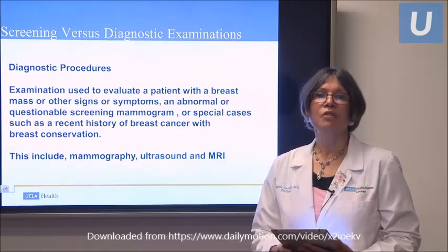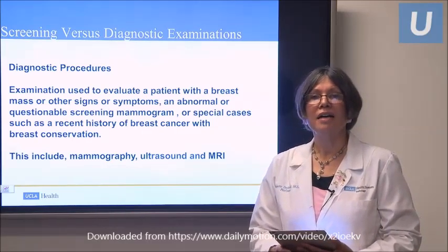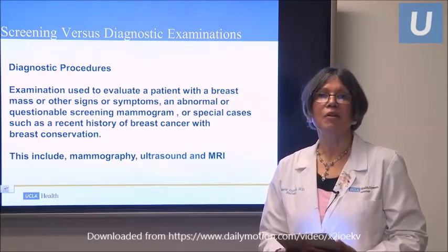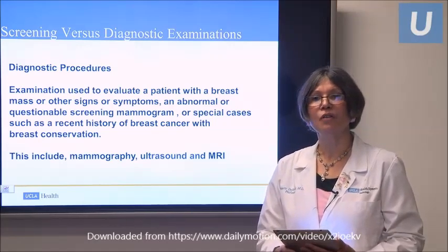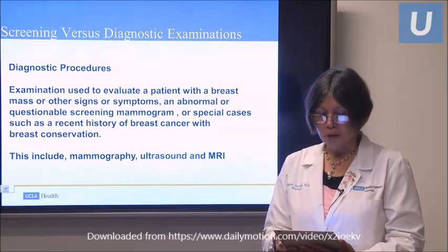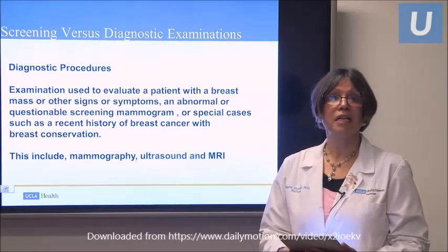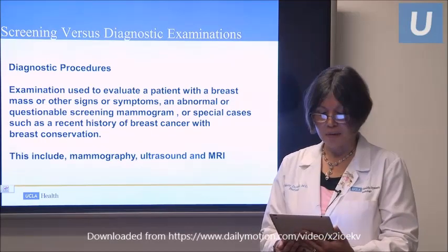It's usually not painful, but it can be firm, and for some women it is painful. Some women actually get a little dizzy with the mammogram. Please let us know if you are a person who faints. We have you sit down and the mammogram is taken. But I would also recommend that you eat. There's no reason why you can't eat and have a regular examination.